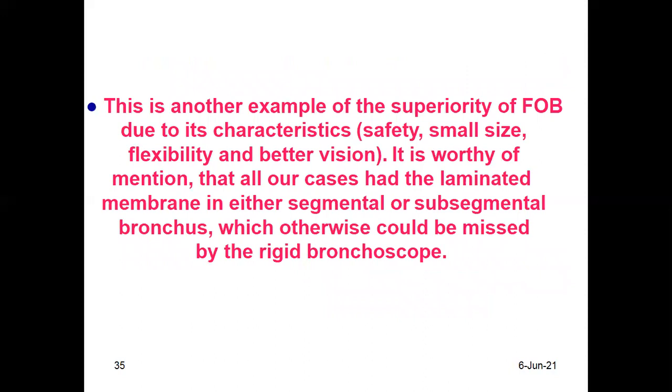This is another example of the advantage and superiority of fiberoptic bronchoscopy due to its characteristics: safety, small size, flexibility, and better vision. It's worthy of mention that all our cases had the laminated membrane in either a segmental or subsegmental bronchus, which otherwise could be missed by the rigid bronchoscope.